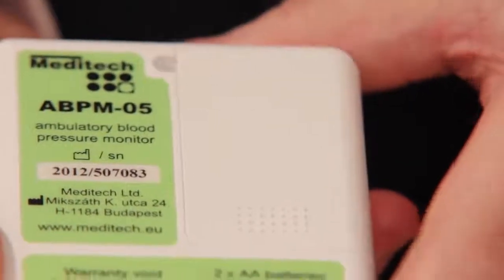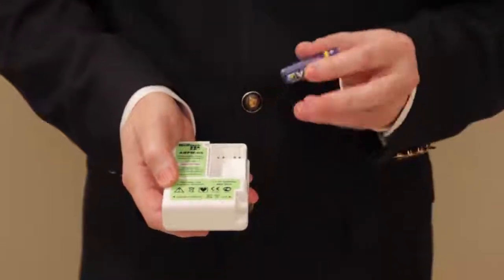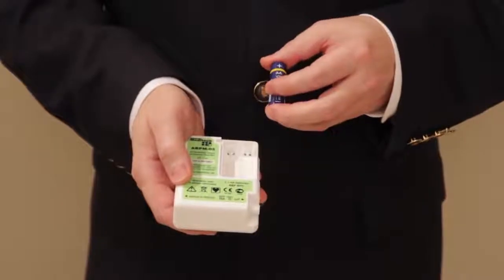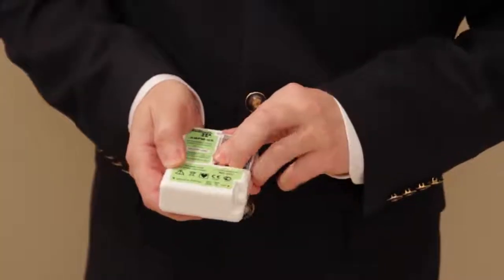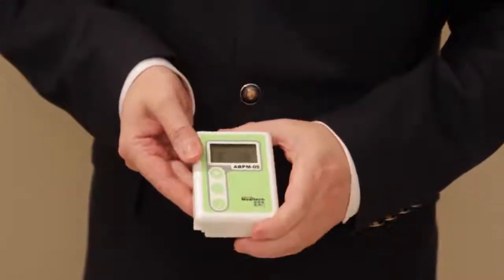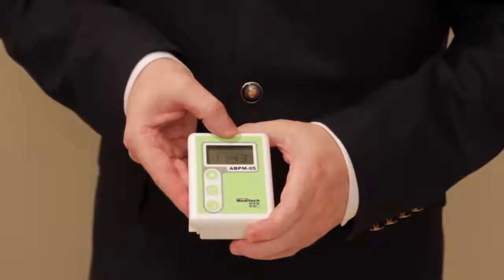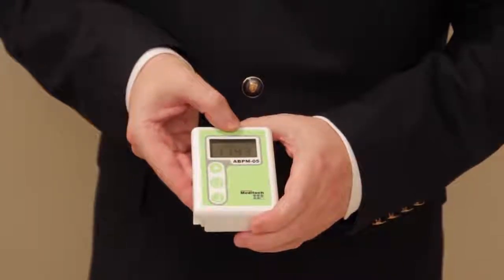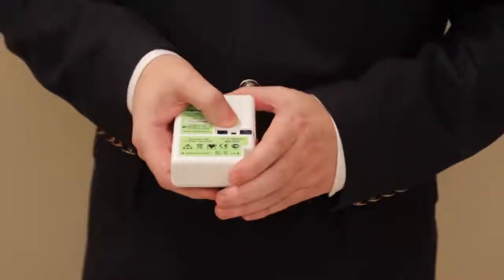So this is the device. Before operating it, you need to open the battery compartment cover on the back side, like this. Then you take the 2 AA batteries and insert them in the battery compartment. Please observe the polarity drawing on the bottom of the compartment. So insert one battery with good polarity, insert the other, and then turn the device to observe battery voltage on the display. With alkaline batteries, this voltage, which is shown for a short time, should be over 3 volts to ensure a 24-hour proper operation of the device. Once you have checked this, please close the battery compartment cover.